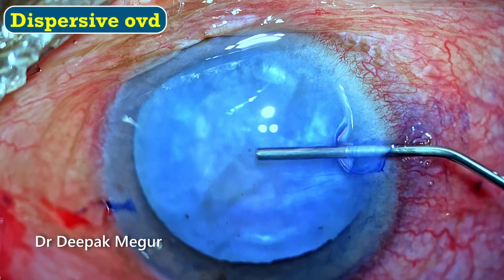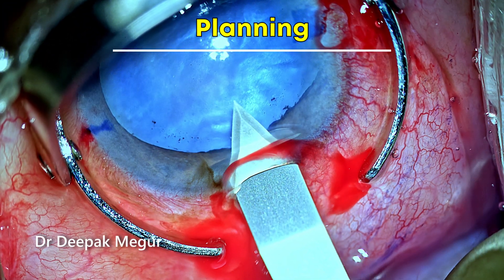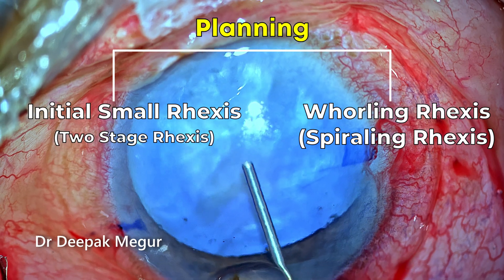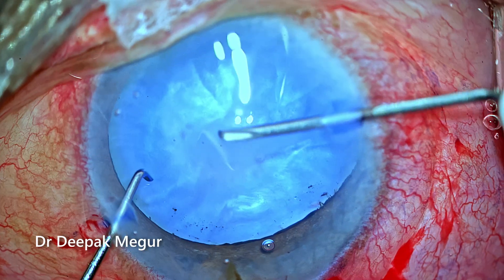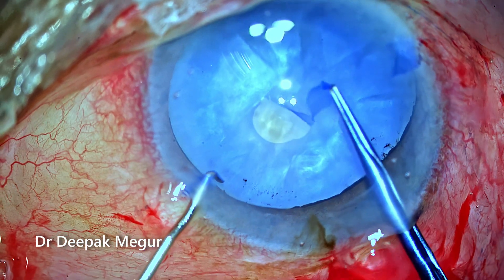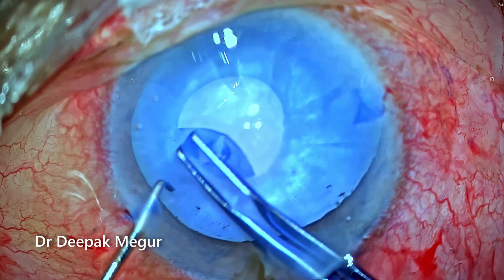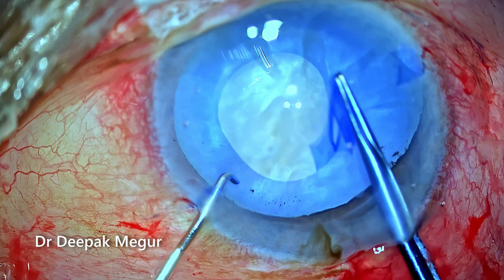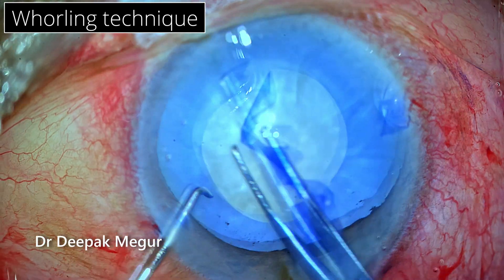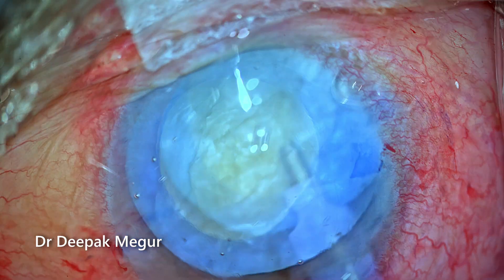The chamber is deepened with dispersive OVD following staining of the anterior capsule. To ensure no extension of the rhexis, I am aiming at a smaller initial rhexis, then maybe try the whirling technique or do a two-staged rhexis. The anterior capsule is punctured with a bent 26-gauge needle and I switch to forceps. The aim is a small 3mm initial rhexis. Since control was quite good, I continued with an enlarged rhexis using the whirling technique, achieving a decent, relatively well-centered rhexis.